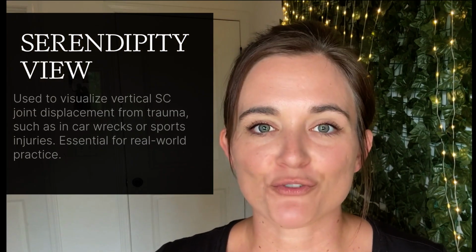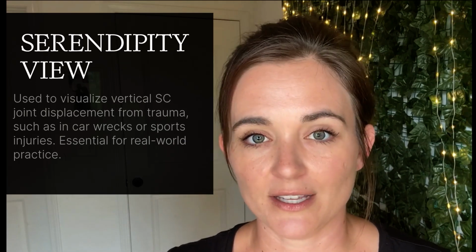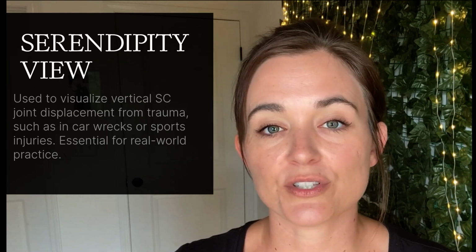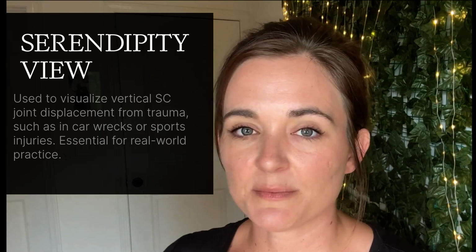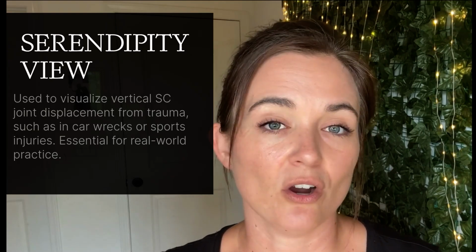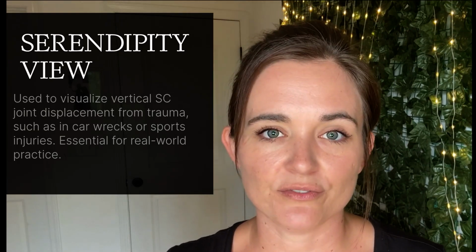Let's talk about a trauma specialty view that isn't in the standard ARRT outline, but it absolutely matters in real-world practice: the Serendipity View for the sternoclavicular joints. This projection helps visualize vertical displacement of the SC joints, meaning if a joint is pushed upward or backward, like in a car wreck or contact sports injury, this is your go-to view.